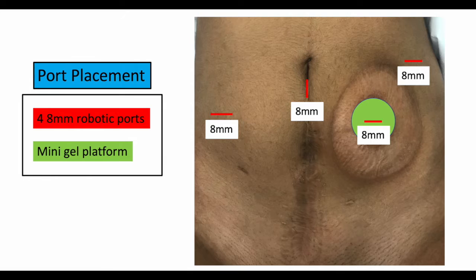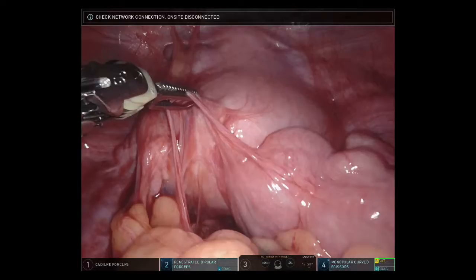To avoid a subsequent laparotomy, we performed a robotic colostomy takedown. We began by taking the colostomy down and then placing a mini-gel platform through the aperture. We then placed four 8-millimeter robotic trocars as shown in the diagram above.